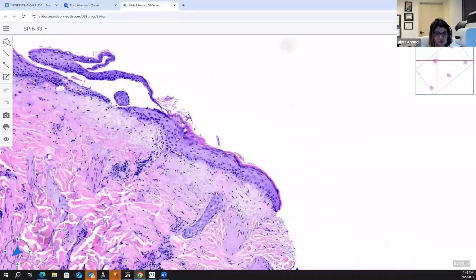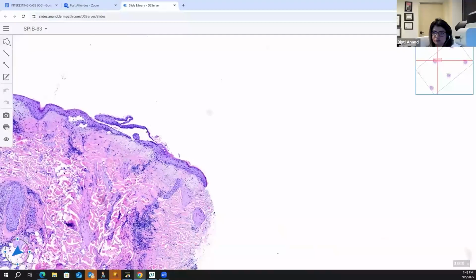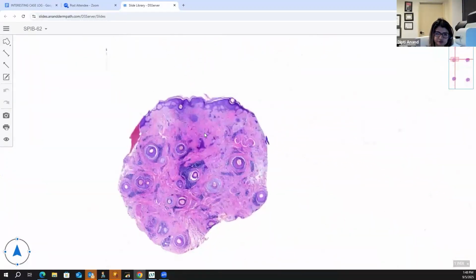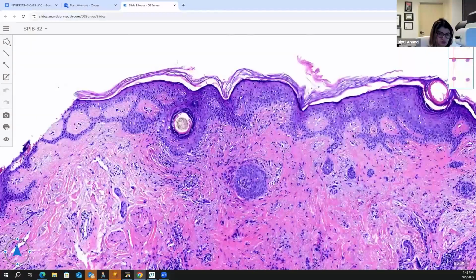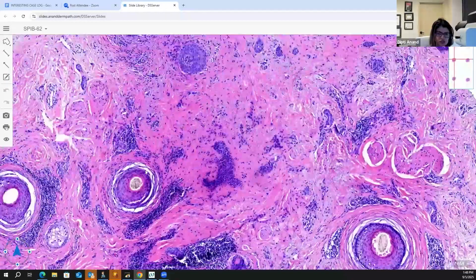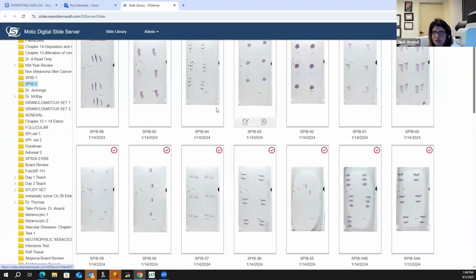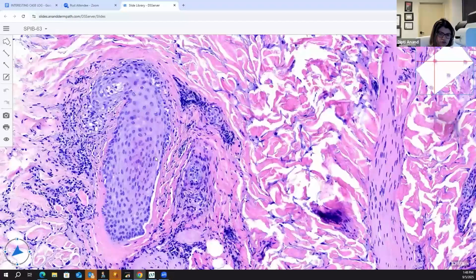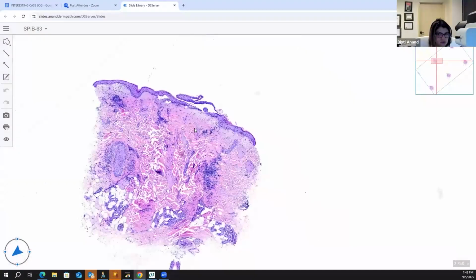And what is this? Discoid. This is discoid lupus. This is in contrast to the previous slide, where you see the epi is normal. The only place it is involved is here, which is the follicular infundibulum. You again compare the same hair follicle. It's just cut off in a different way. Compare this with this. This is also the hair follicle, but you see, it has no fibrosis. It has thickened basement membrane and the inflammation. So this is DLE. You see the difference?